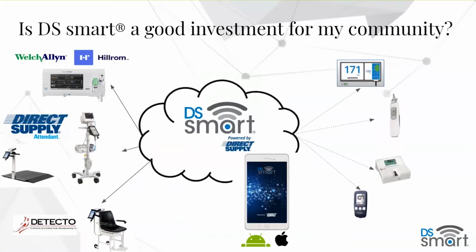Like we had mentioned a couple slides before, the two capabilities that we have are the vital sign monitors and scales. And you can see from the scale standpoint, we have a variety from dual ramp wheelchair scales to some wall mounted scales from Detecto, chair scales. So quite a variety for the community to pick from to best suit the needs of the residents that you're serving.